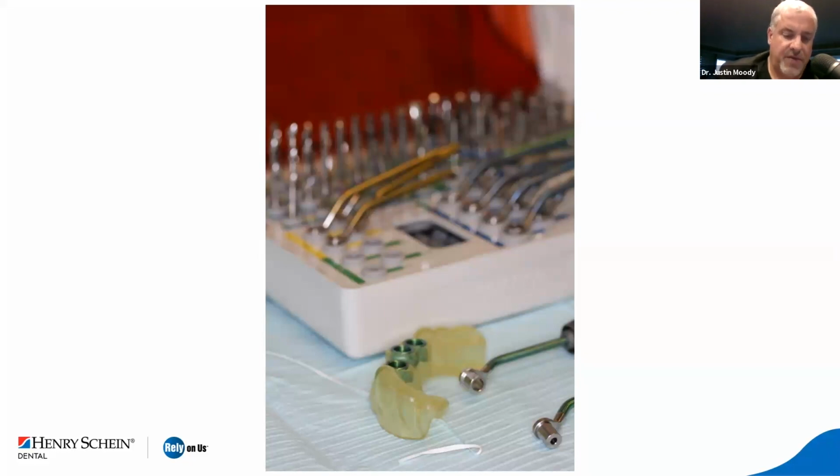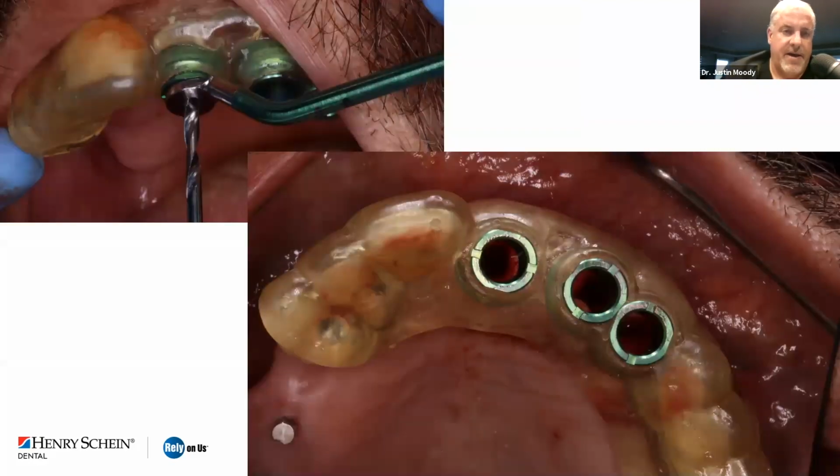The same thing with authentic parts from BioHorizons. You would never want to use a part that wasn't authentic, because it's not going to fit the print exactly. It's not going to print the keys exactly, and the implant and the hex timing is not going to be exact as well. Here we have a couple images of this case in the mouth.